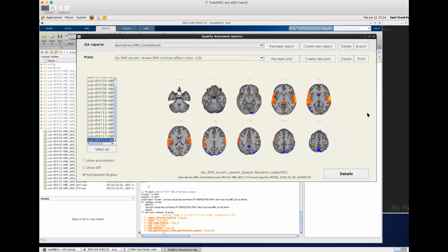If you want to, in our FrankLab scripts, actually remove them separately, just mark them as non-parametric. Remember the NP mod field, just mark that condition that you want to estimate non-parametrically, and that will estimate that condition separately for every trial, the invalid ones, so that will be effectively equivalent to the way that Art does it. I see. Okay.